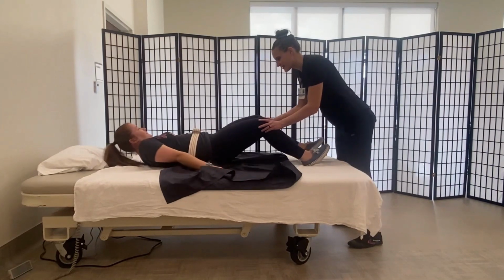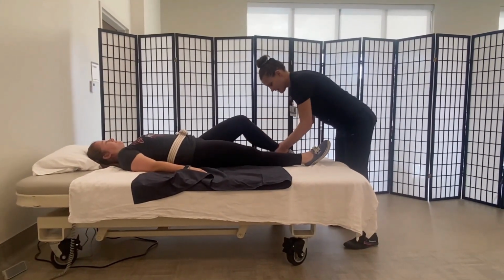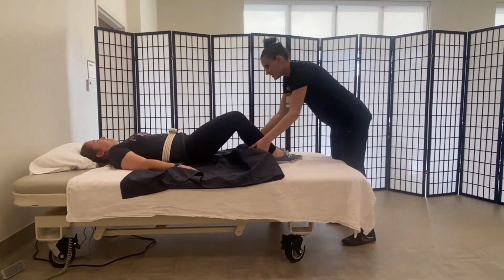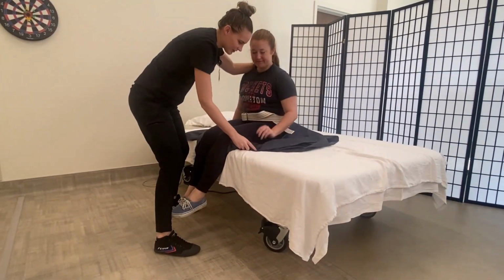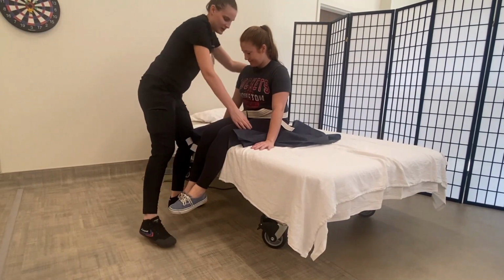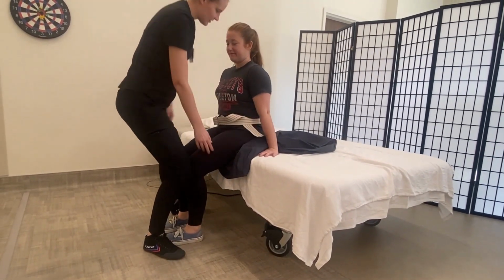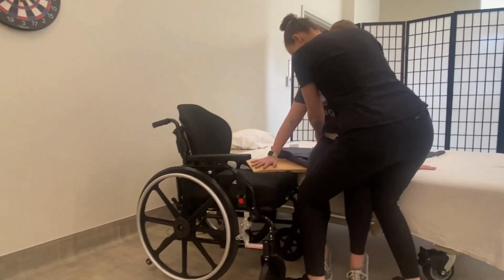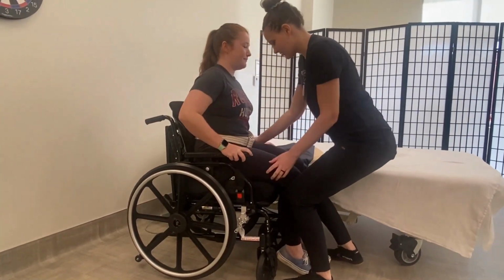With in-bed mobilization, sheets can be used to raise a patient to the head of the bed or lower to the foot of the bed. It can assist with rolling a patient left and right and side to side in the bed. Friction-reducing sheets can also help a patient to scoot closer to the edge of the bed or positioned with slide boards to aid in slide board transfers. An important reminder is to never leave a friction-reducing sheet under the patient, as it can increase potential for falls.